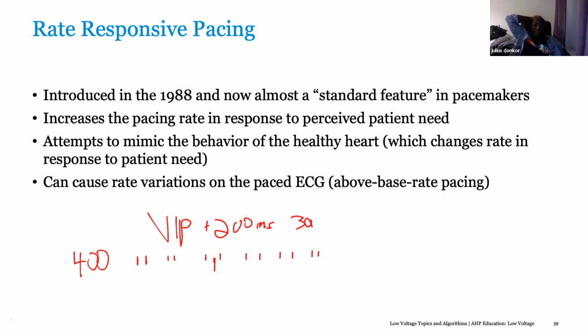If it's an intermittent complete heart block, you can certainly set it that way, and it will search the AV node over a few cycles, and if it goes into complete heart block, it will switch to DDD on its own. So all the Medtronics have that. The new ones have that. But the old ones which they sent to us here, Sentia and Sphera, as I said, Sentia doesn't have that. Even the Sphera they sent to us in Africa, they don't have it.